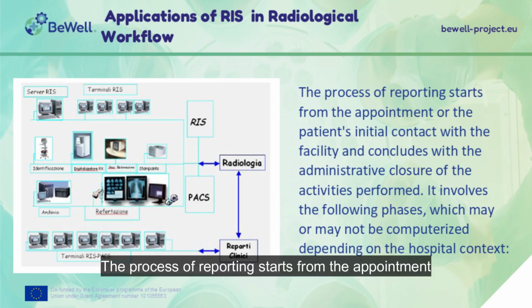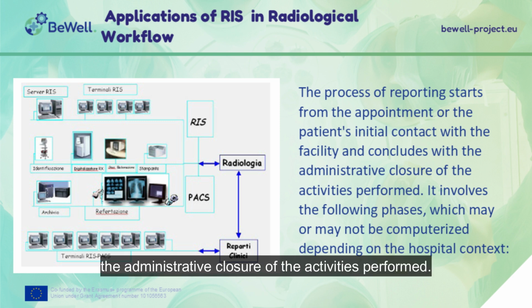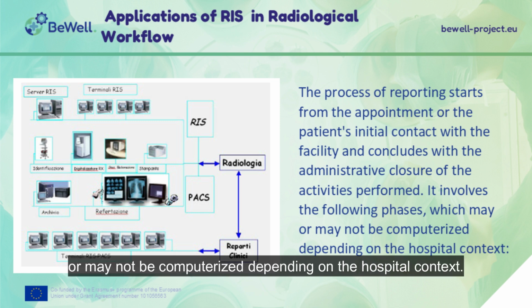The process of reporting starts from the appointment or the patient's initial contact with the facility and concludes with the administrative closure of the activities performed. It involves the following phases, which may or may not be computerized depending on the hospital context.